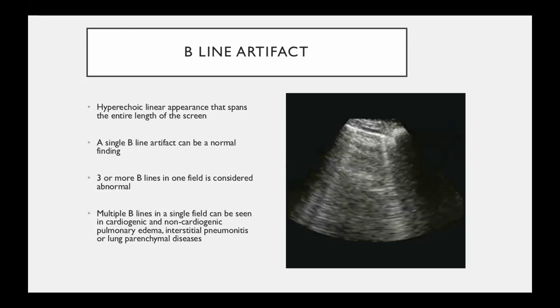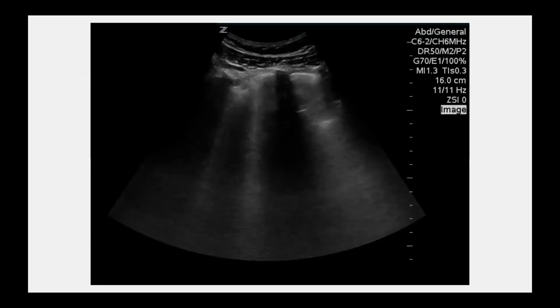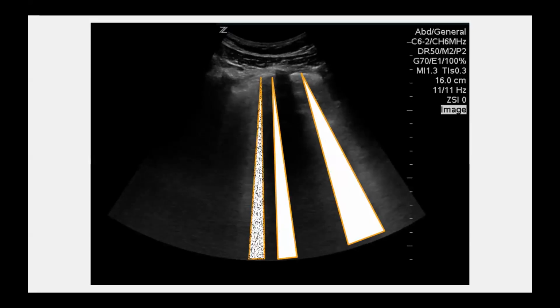But one point that's important is, if you're trying to differentiate between someone who has potentially CHF versus COPD, looking at certain patterns on their lung ultrasound can help you and provide you with some more data. Someone who has a ton of B-lines is probably more suggestive of CHF as opposed to someone where you're seeing predominant A-lines and lung sliding, probably more likely COPD, again, taking your whole clinical picture into consideration. So here's an example of a clip that just demonstrates various B-lines, and you could see them extending the entire length of the field.